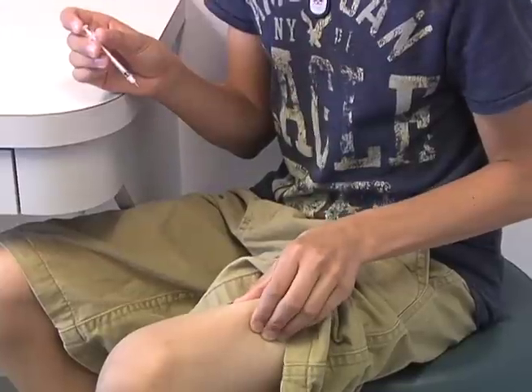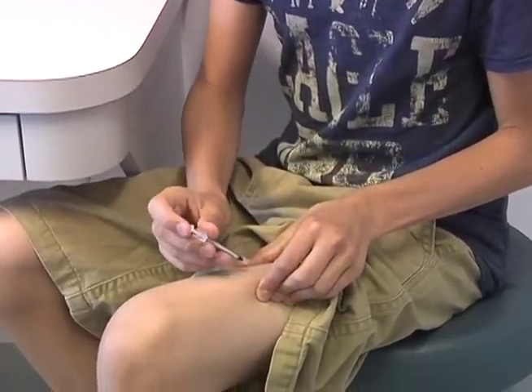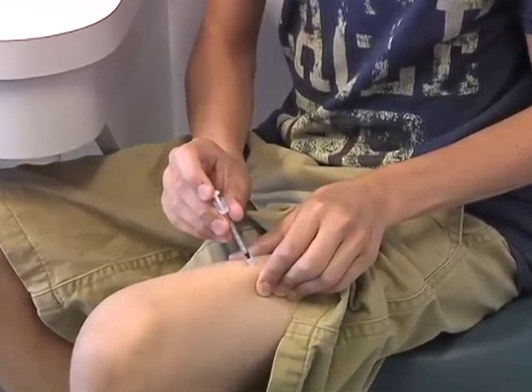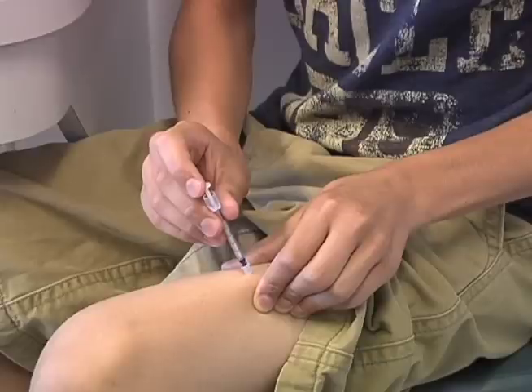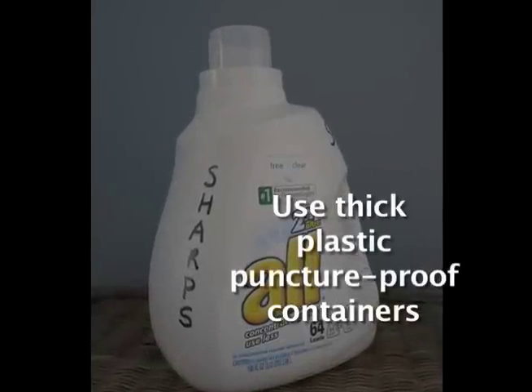Soap and water are preferred for cleaning since alcohol can dry the skin over time. Inject into fatty tissue. Depending on the amount of fatty tissue and the length of the needle, gently lifting the skin may help to keep the tip of the needle in the fat instead of the muscle. Wait about 5 to 10 seconds before taking the needle out of the skin — waiting helps prevent insulin from leaking out. Dispose of the syringe in an appropriate puncture-proof sharps container.